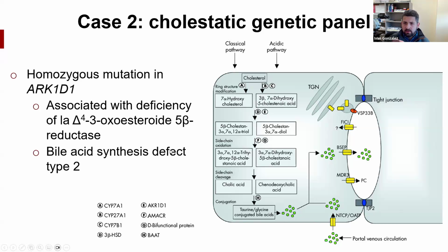As mentioned earlier in the talk, a lot of these patients are getting this cholestatic genetic panel. Unfortunately, for most of them, if not all, I don't have that information at the time I'm reviewing my liver biopsy. But hopefully, a week or so after, we have it back, and our clinicians are pretty good at giving us that feedback on what turned out to be.